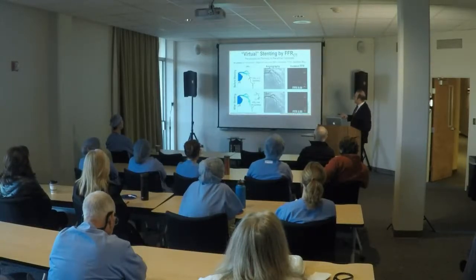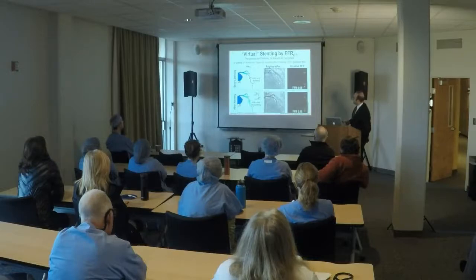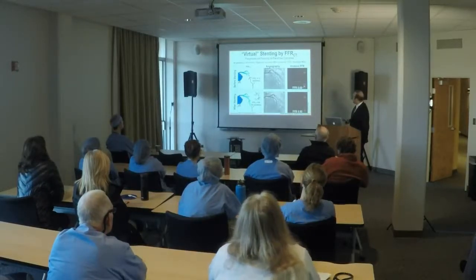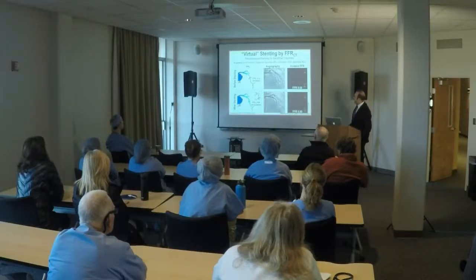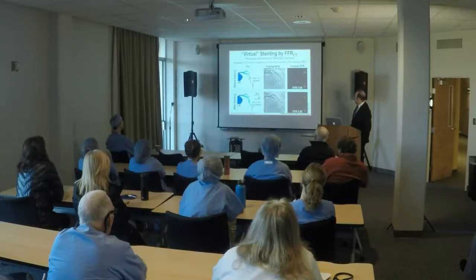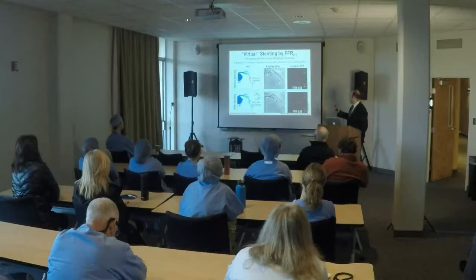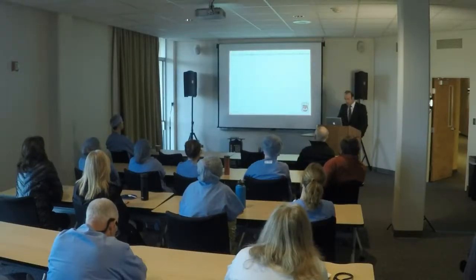This was 44 patients that they assessed, and the overall diagnostic accuracy was 96%. This is before stenting, an ischemic LAD lesion, and that was corroborated on invasive FFR. And then this was the virtual stent that after you place this stent right here, the FFRCT would be 0.86, and this is post-PCI, and the FFR went up to 0.9. So again, using the same computational fluid dynamic algorithms to predict therapeutic benefit of revascularization.